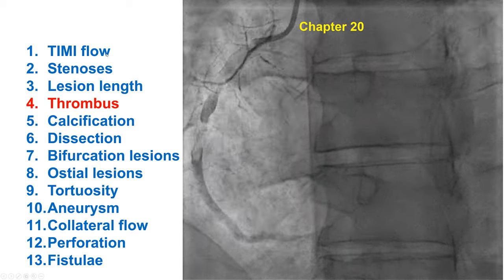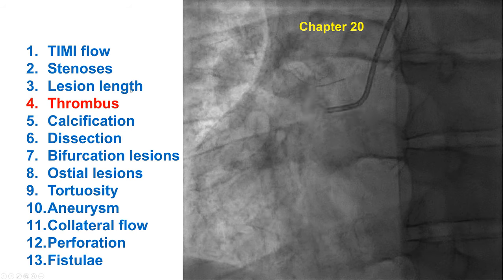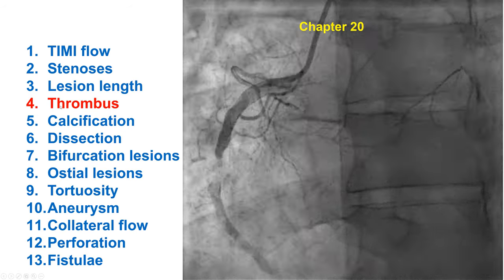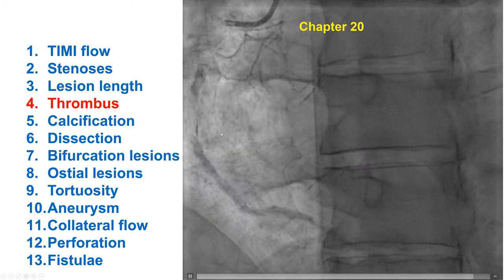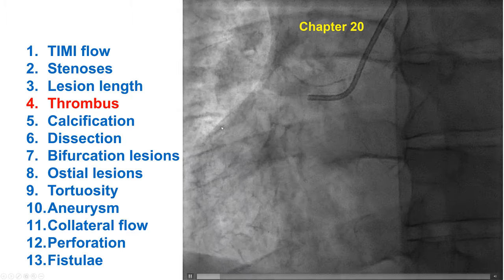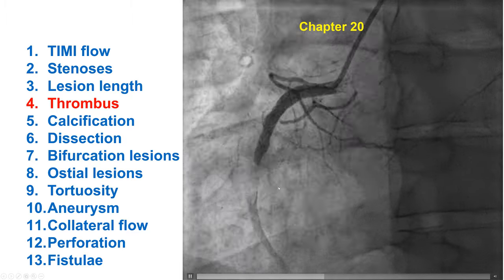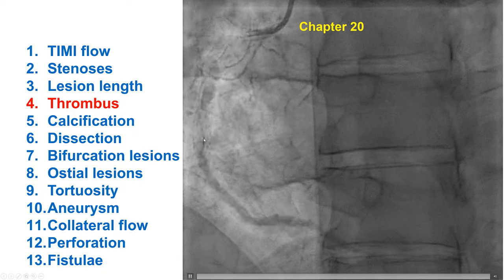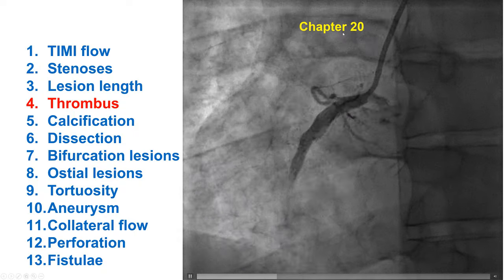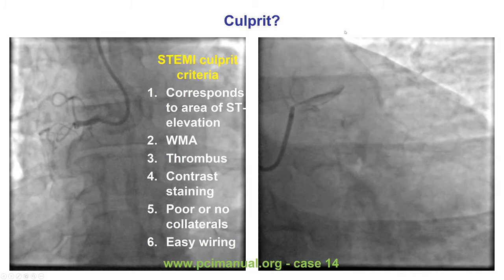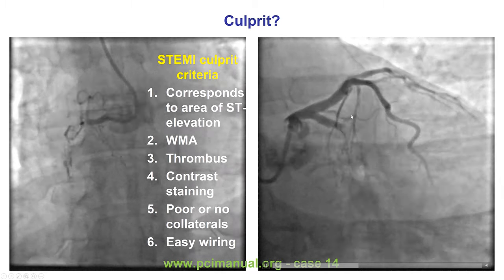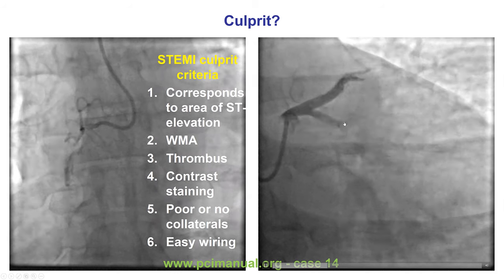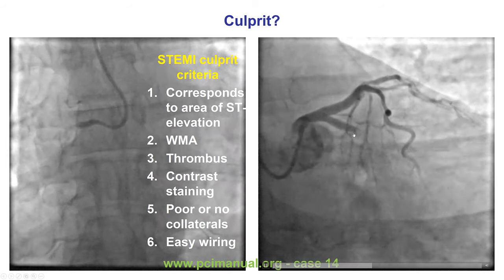After assessing TIMI flow, stenosis, and estimated lesion length in millimeters, the next characteristic to look for is thrombus. Normally, there should be no filling defects within a coronary artery. This is an example of thrombus as a round filling defect, discussed in more detail in chapter 20. This is another example of a round filling defect in a patient with acute myocardial infarction, also representing thrombus.